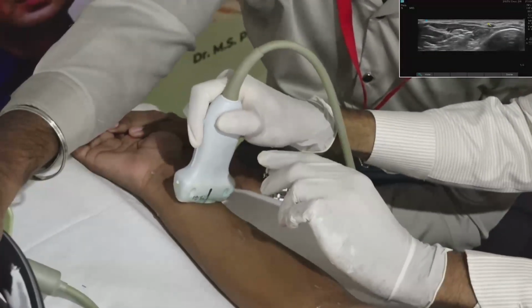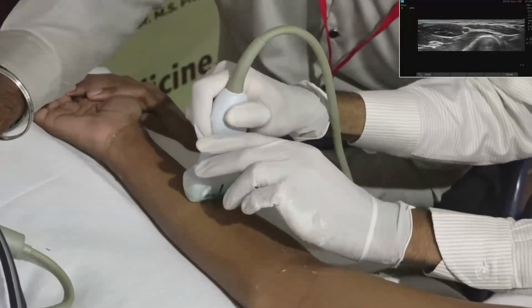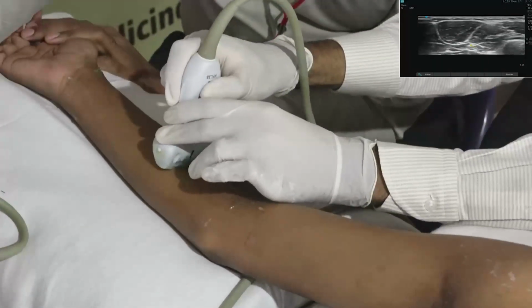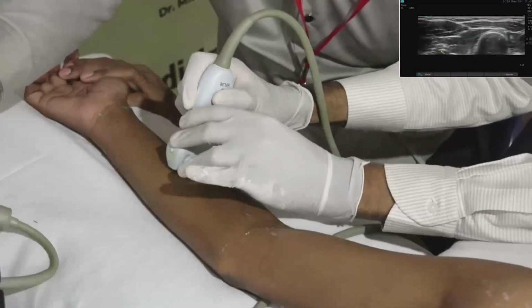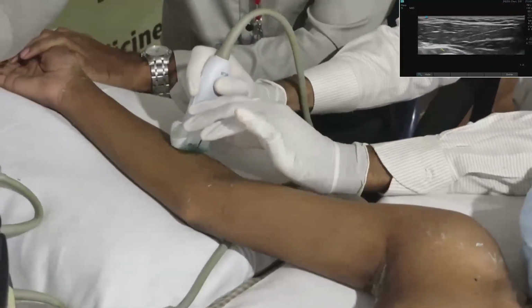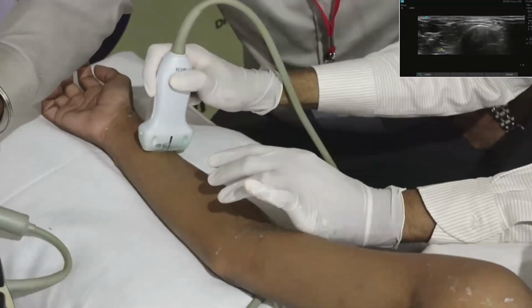So you have to look for that muscle next to the artery that is becoming bigger and bigger. We all know the bulkier muscle in the lateral aspect is brachioradialis. That is what we are trying to see here along with the radial artery.